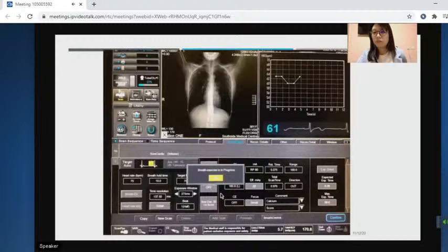Okay, because it was fast just now, so I have captured this to explain further. So this is a breathing test, which is to monitor if the heart rate is stable. The machine will always allow a plus minus 10 BPM. Means if your heart rate is 61, the lowest the machine allows is 51, and the highest will be 71. There is always a gap for the machine to evaluate if the patient is suitable to continue.